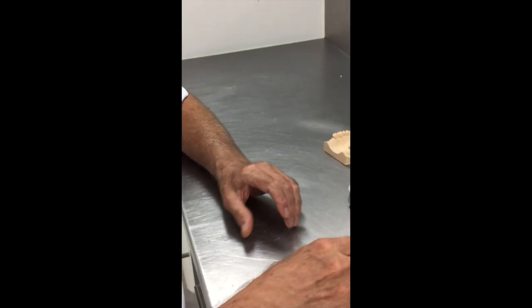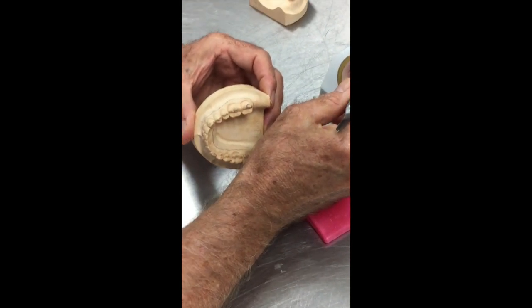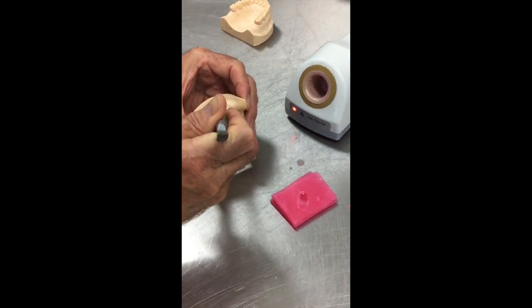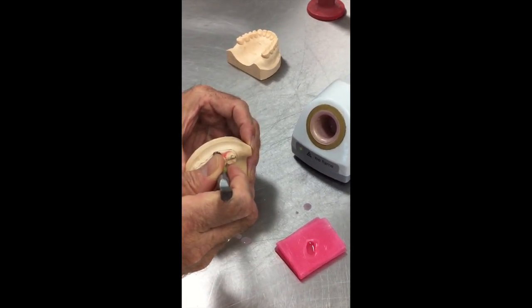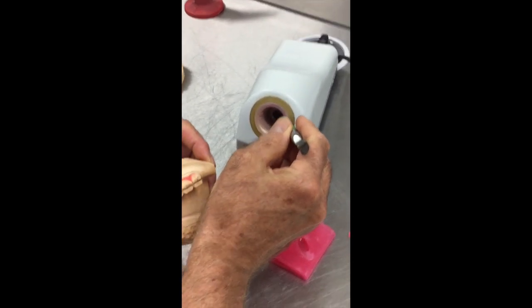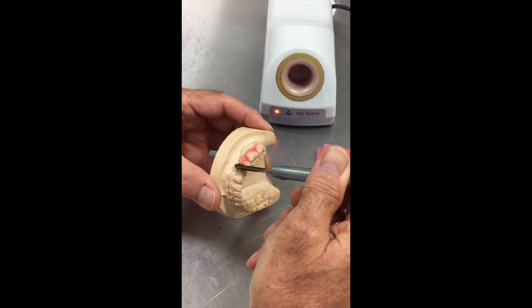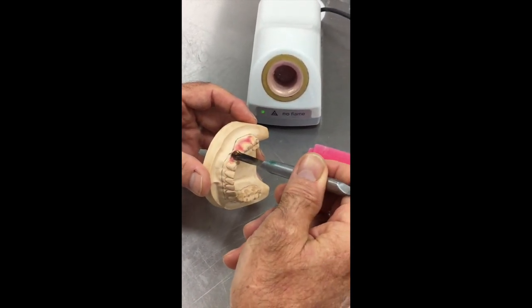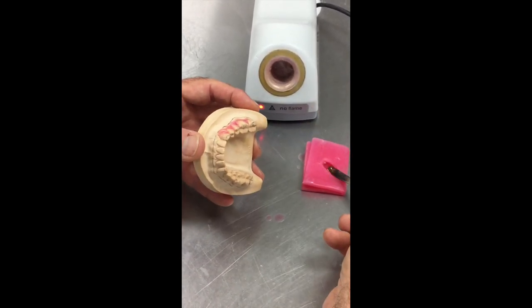Okay, so we take some standard wax, and there's no great science to this. All we're going to do is heat the wax and fill up the obvious undercuts in our model like so. We're just going to run around and fill these. If you get your wax hot enough, it will flow and fill those areas quite easily, because it's finding its own level and filling the undercut. Okay?